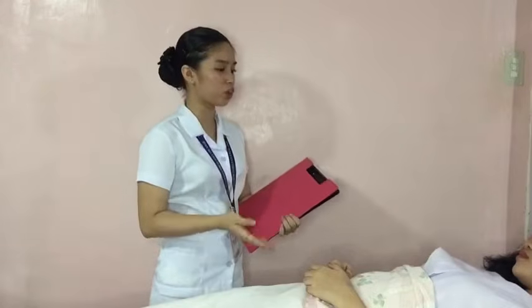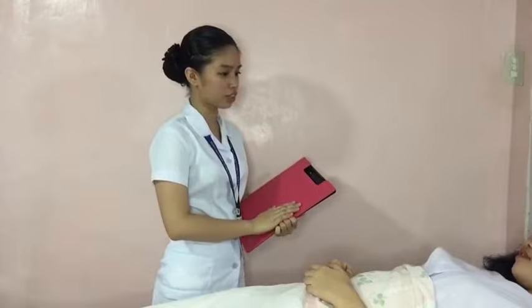Yes. As you can see, the curtain is closed so that there will be no other people who can see us, and of course to provide you privacy. Do you have any clarifications or concerns? None so far. Okay, we are going to start the procedure, ma'am.